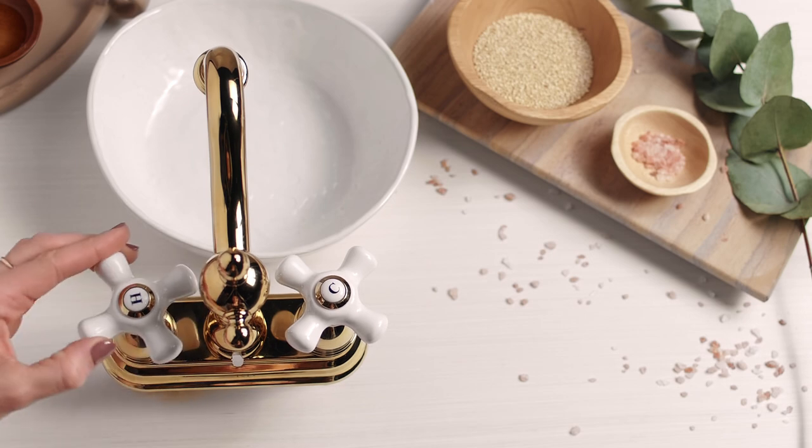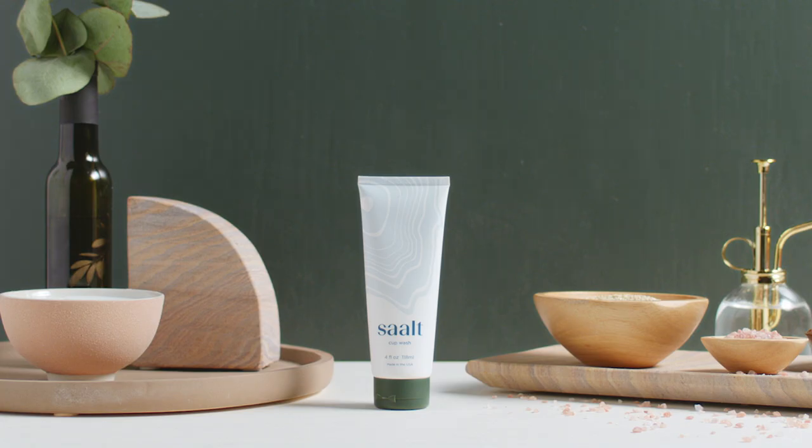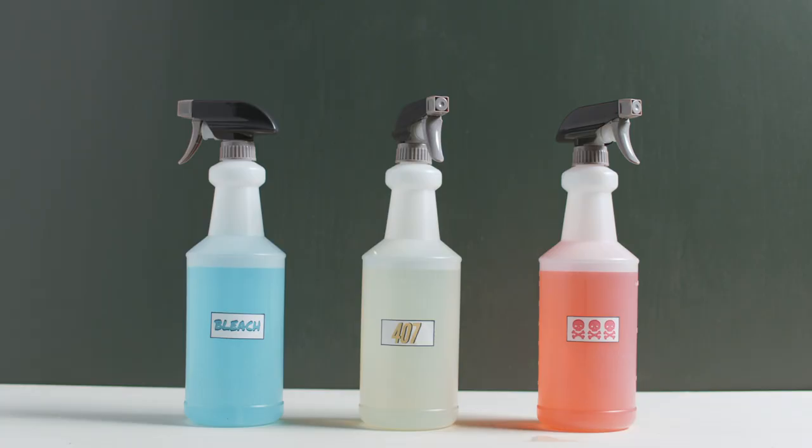After your cycle, you'll want to give your cup a more thorough cleaning before storing it for your next period. Start by washing your cup with hot water and mild soap or our salt cup wash. Avoid strong cleaners that could irritate your skin or leave behind a residue.